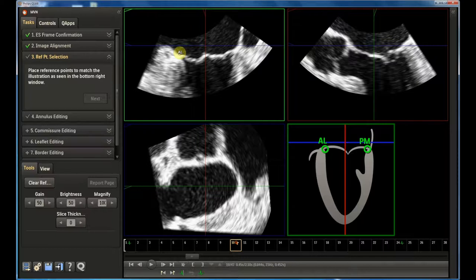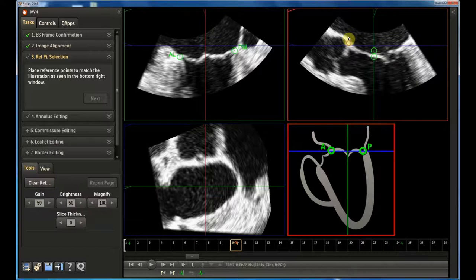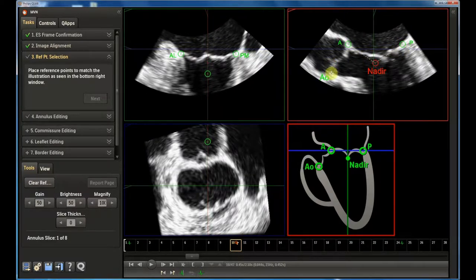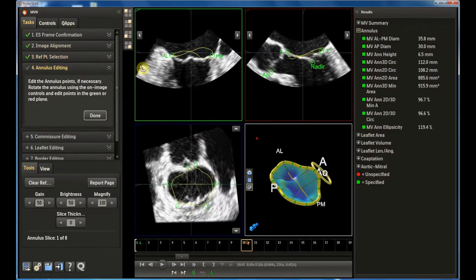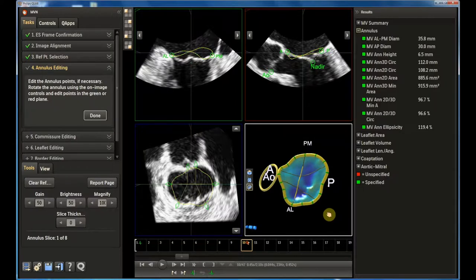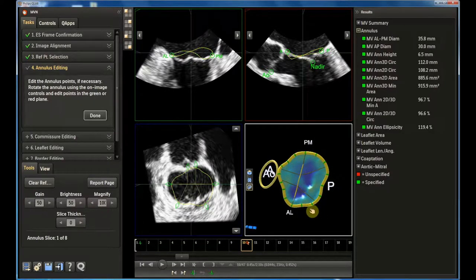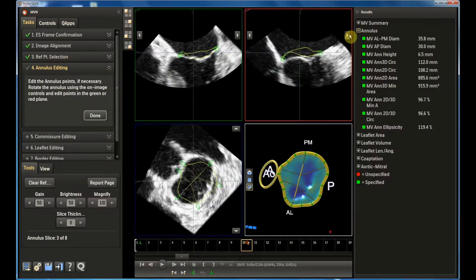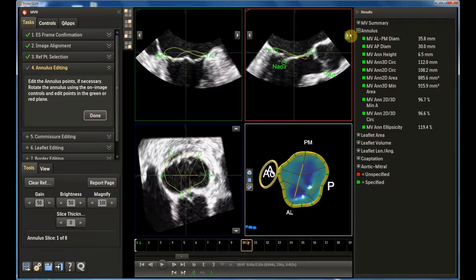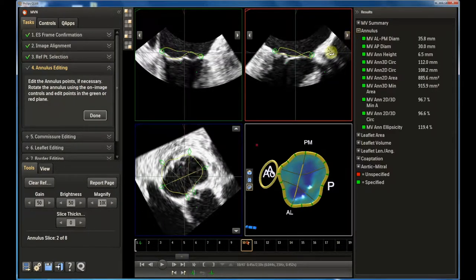In the third step, the task is to place the reference points for the MV model as shown in the graphic representation. After the aortic point and the nadir placement, a first model of the valve is automatically computed. The annulus boundaries are manually refined by optimizing the position of 6 more couples of points in a corresponding number of rotational planes, 1 every 20 degrees for a total of 16 annulus points.